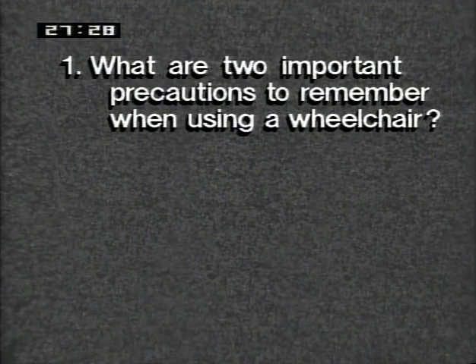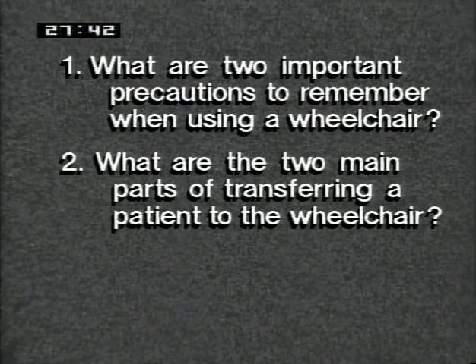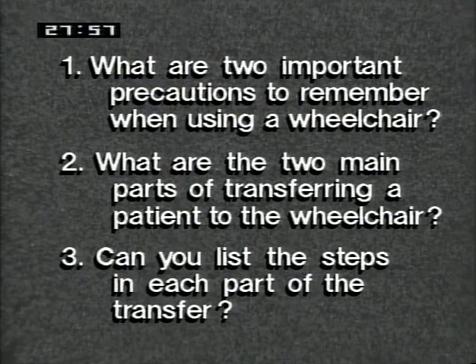There are many important principles and precautions which apply to the use of the walker and wheelchair. Do you remember them? What are 2 important precautions to remember when using a wheelchair? What are the 2 main parts of transferring a patient to the wheelchair? Can you list the steps in each part of the transfer?